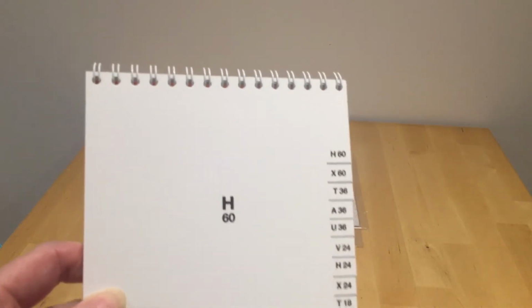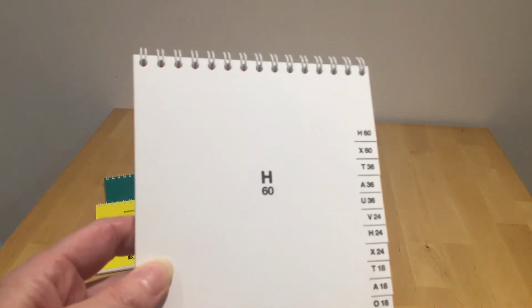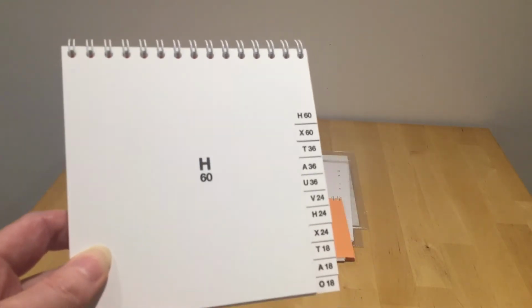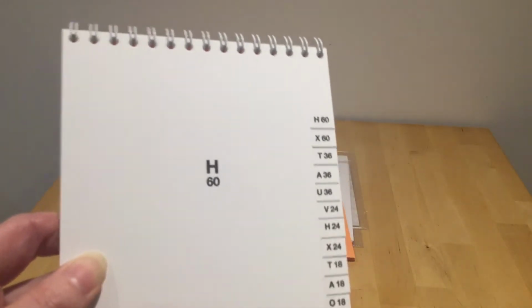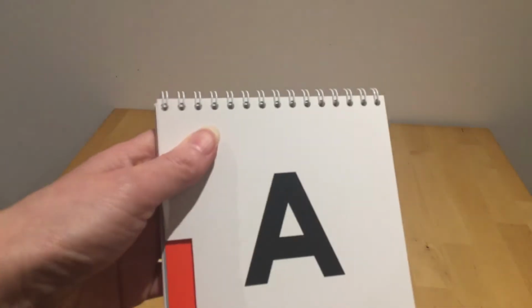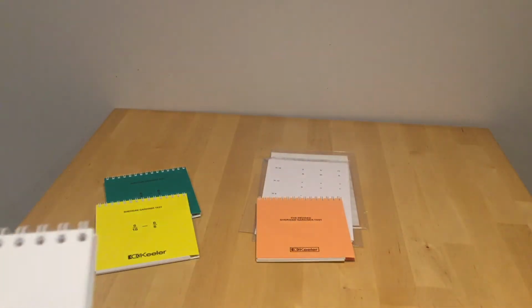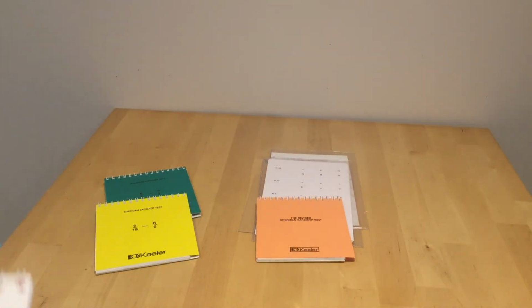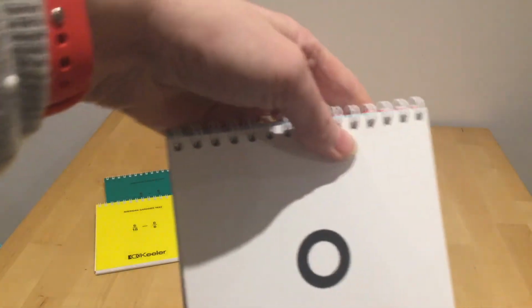So again, you can decide whether to give every single letter at value 60. There is a limited range of letters used in this test. Or you can decide if you're going to skip on. Let's do A 36, flip over, and there it is. So capital letters, and this goes to 18, A at 18, and O at value 18.